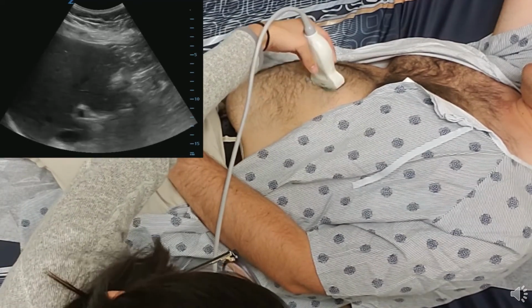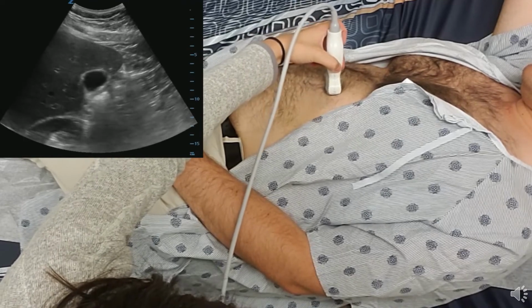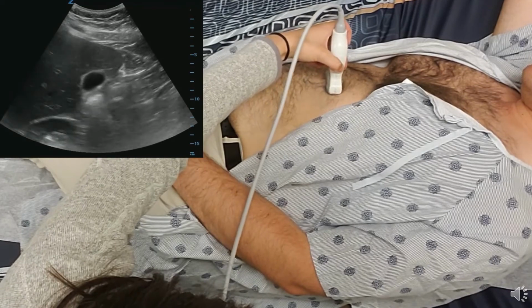And of course, in order to make it a complete right upper quadrant ultrasound, I looked in both the sagittal and transverse views, making sure to sweep through the entire gallbladder in both axes.